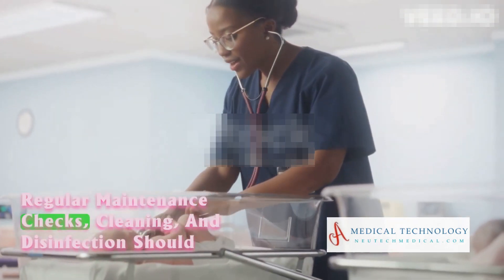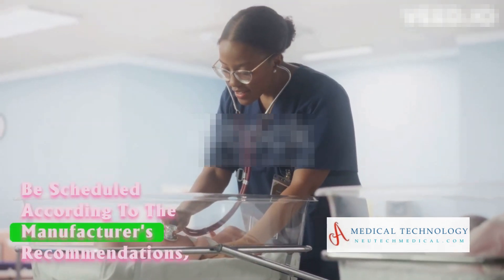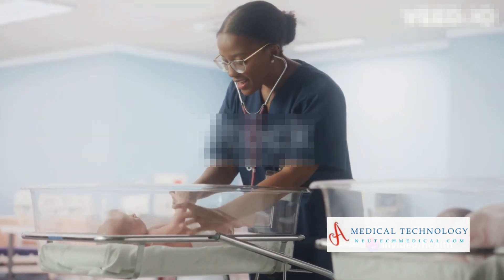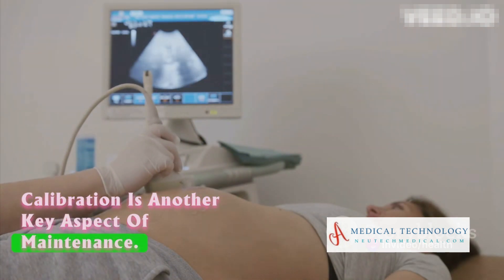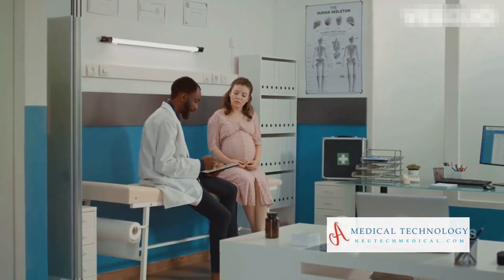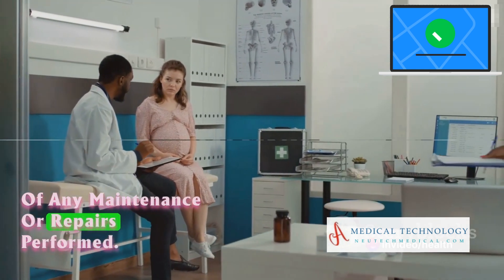Regular maintenance checks, cleaning, and disinfection should be scheduled according to the manufacturer's recommendations and the healthcare facility protocols. Calibration is another key aspect of maintenance. Calibrate the equipment periodically to maintain accuracy. And don't forget to keep thorough records of any maintenance or repairs performed.